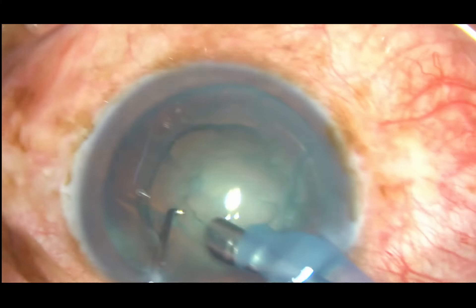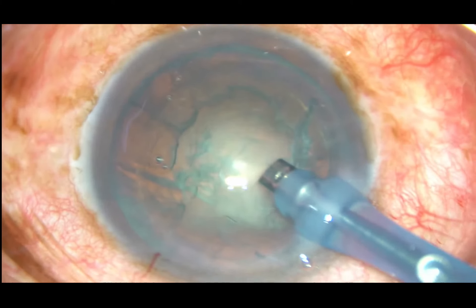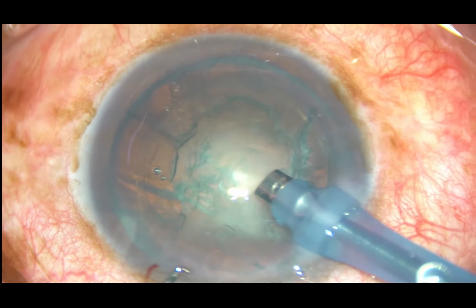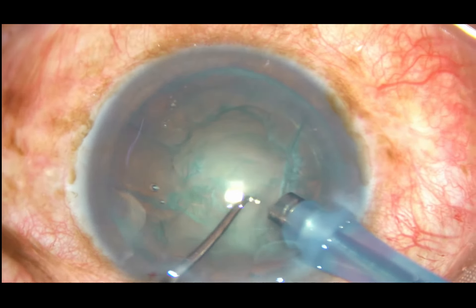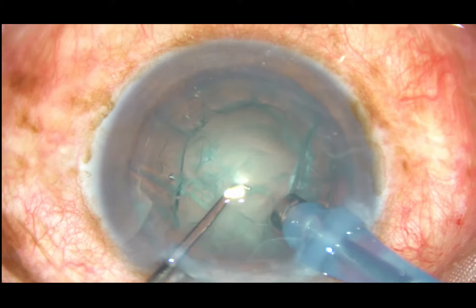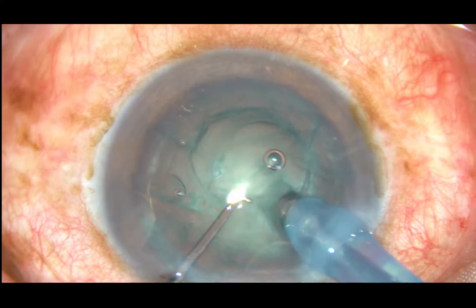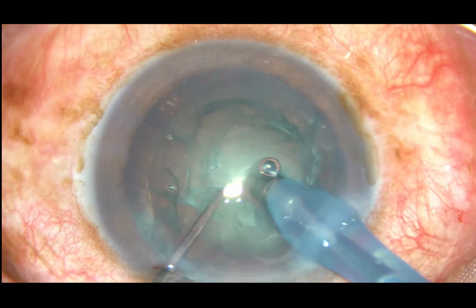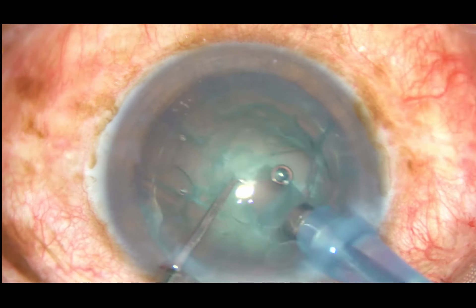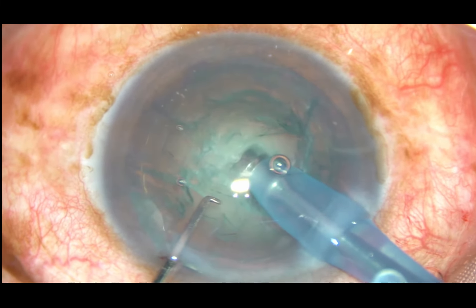Now let us remove some cortex for better visibility. Then introduce the chopper and be in phaco-on mode where the vacuum is very low — say about 50 mmHg, flow rate about 25, and power according to the hardness of the cataract. In this case it is 60%.